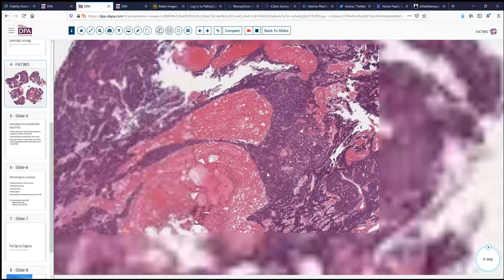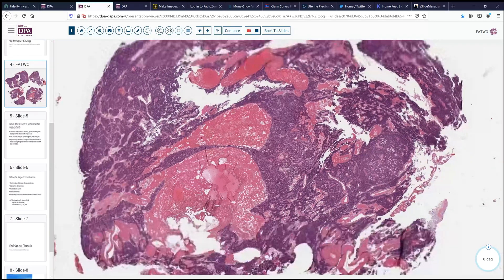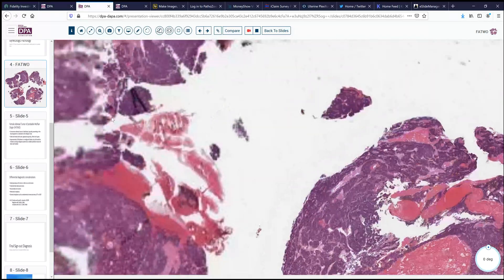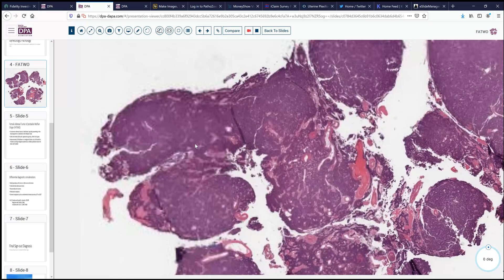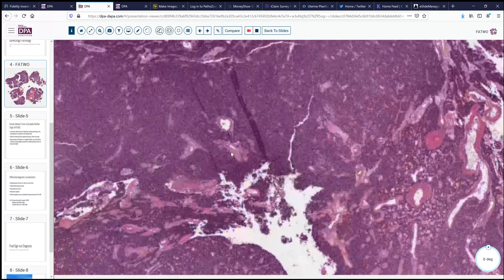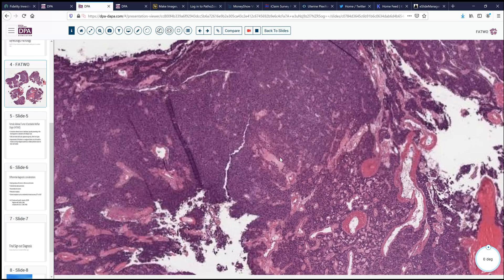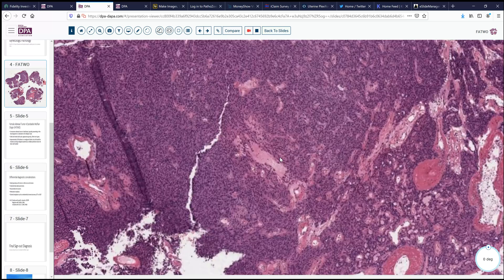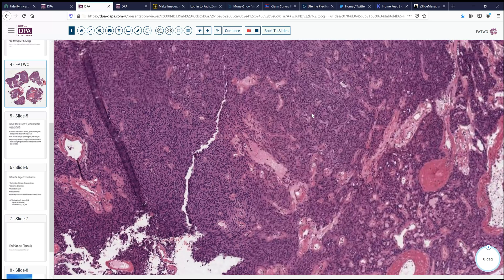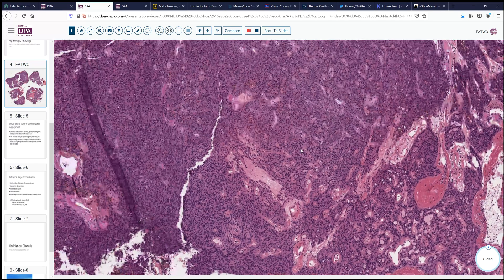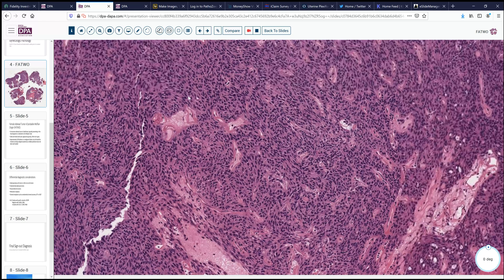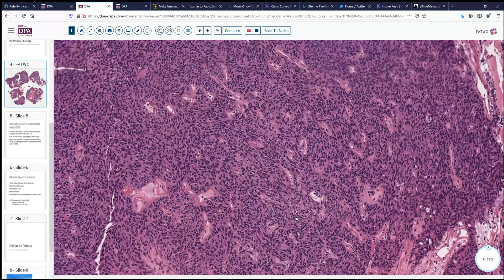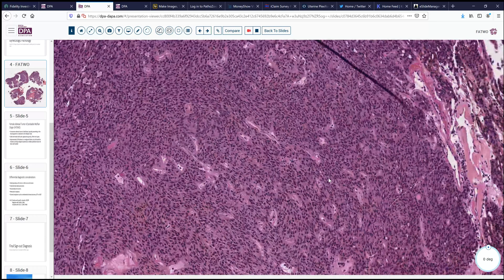Let's go to another area of the lesion, which shows a very prominent degree of spindle cell type morphology. Here we can see a more solid pattern with many of these cells forming sort of a streaming, vaguely spindle-shaped pattern in these areas as well.